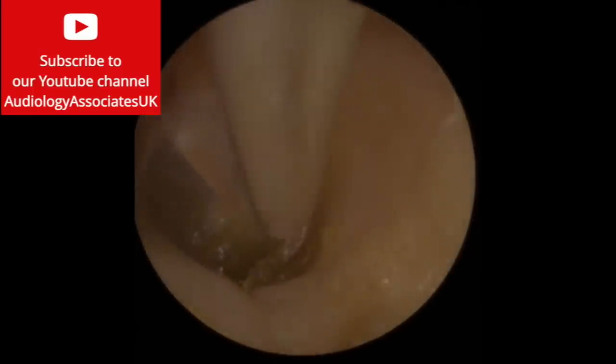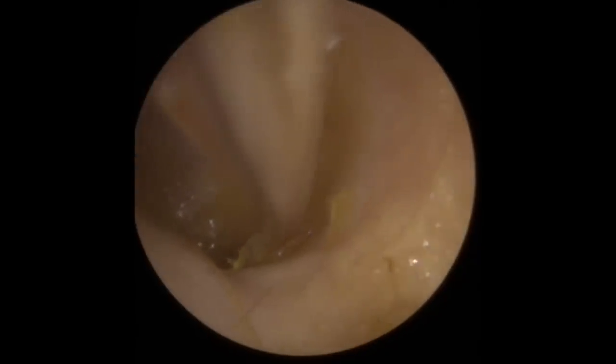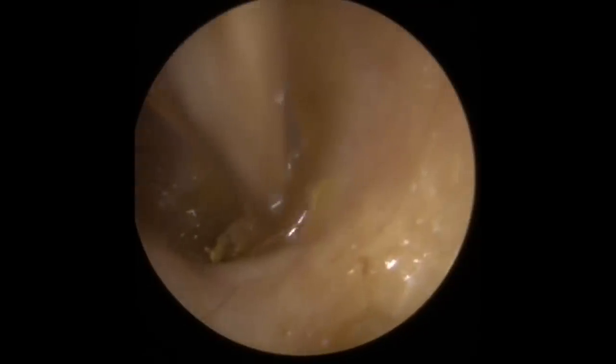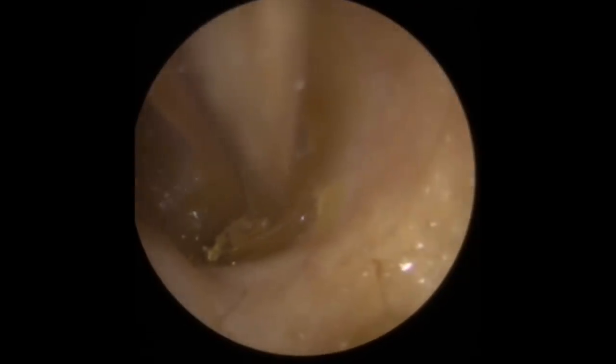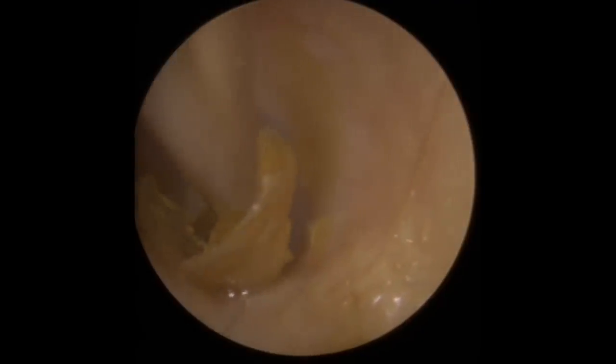So you can see it doesn't always mean that we have to have huge amounts of wax in there to cause problems. Sometimes just a small amount in the wrong place can be just as problematic. Because this is very deep, we're going to use the fine end here just to get a grip on this outside edge. You can see a little bit of olive oil's been used there. It's just sitting underneath that plate. And as we get a grip and pull, there. That's the first section.